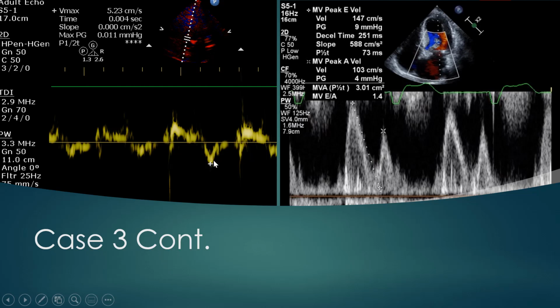So if I do my mitral, my E prime is 5. So again, I have my tissue Doppler set here at the left ventricle, at the medial annulus, and it's 5 centimeters per second. So that's low. So remember, the cutoff I use is less than 8. So I know I have impaired relaxation. And I'm doing my E and A, right? So I have my E wave, my A wave. So my E is bigger than my A. And so I am at least stage 2, maybe 3.